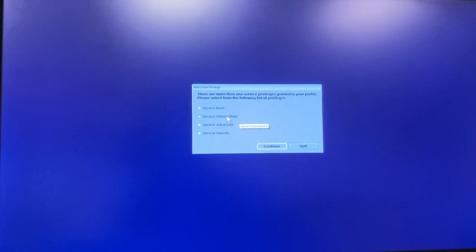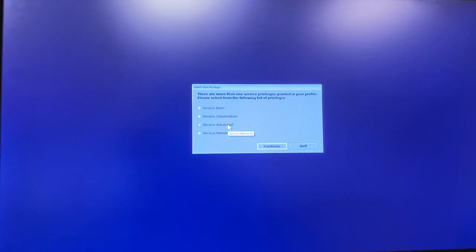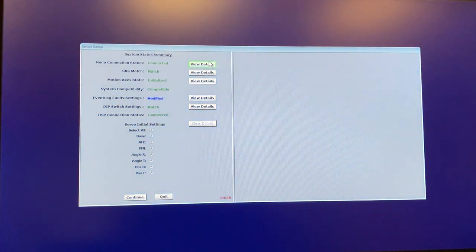One thing you cannot do in advanced is change the output of the machine, since that was intended only for service engineers — and service engineers shouldn't change the output; that should only be done by physics. So there is actually one feature only available in intermediate. We typically go into advanced and then log out and back in as intermediate only when we need to change the output. Other than that, there aren't many differences between advanced and intermediate.